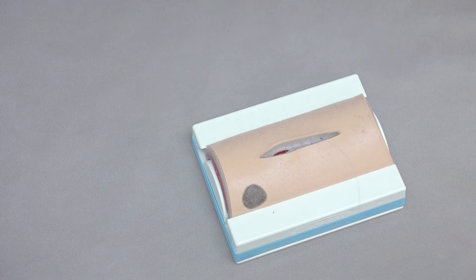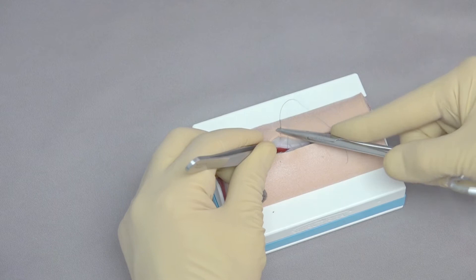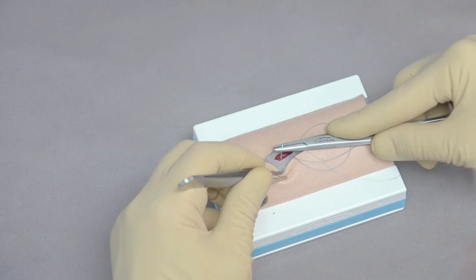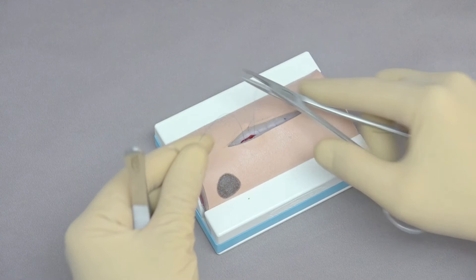When it comes time to finish the continuous pattern, as we get close to the end, take a final bite on the far side of the incision, stabilizing with the needle holders and bringing it through. But don't finish this loop — leave it in place, because we'll eventually tie to it. Then come to the near side, position the needle, and this loop is what we will tie to.